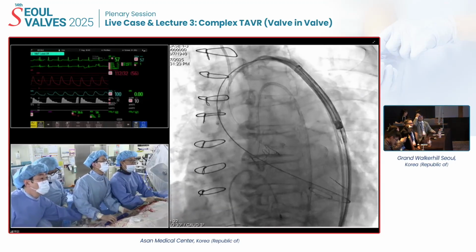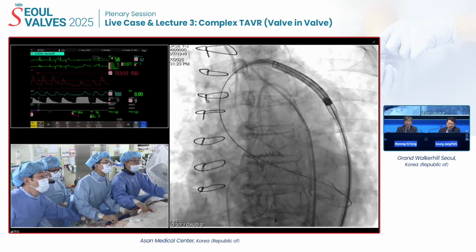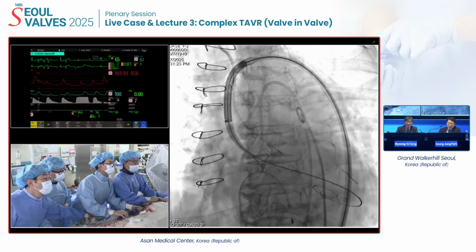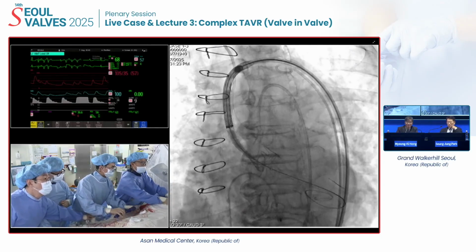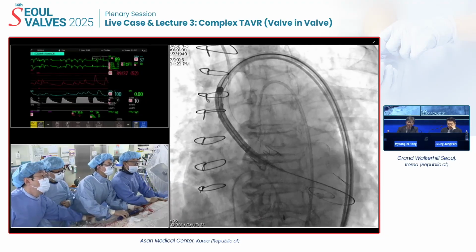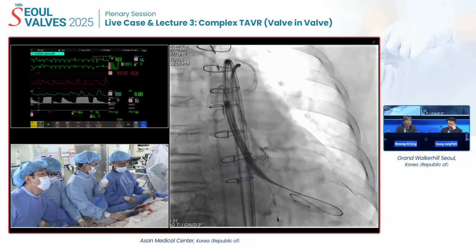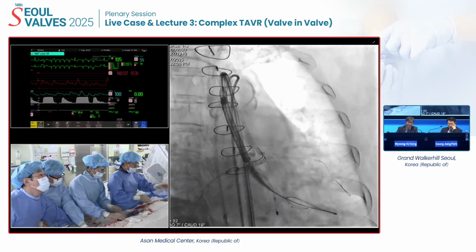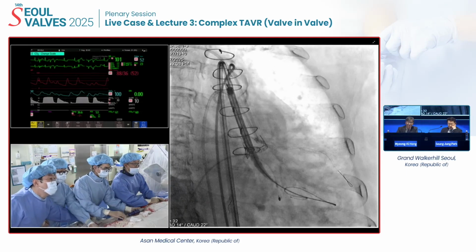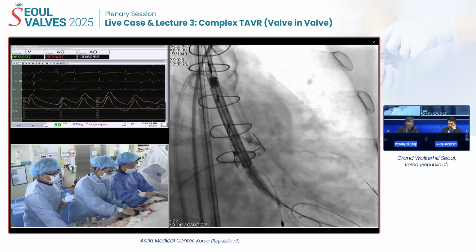Hand mark was the lateral part, and then the pigtail over here, and the negotiation is so important. And then we push, and then put the pigtail over there, and then push. Okay. Cusp overlap view. And the landing position usually in the valve is 3 to 5 millimeter below, and zoom. Okay, here we absolutely have a landing mark.